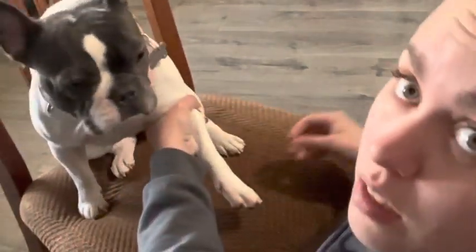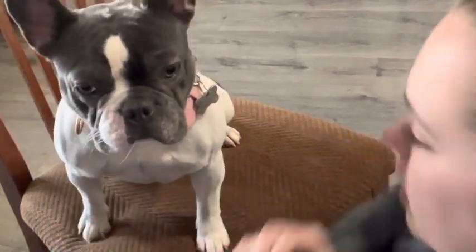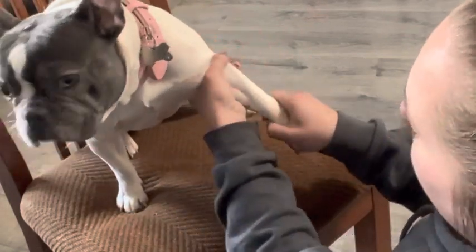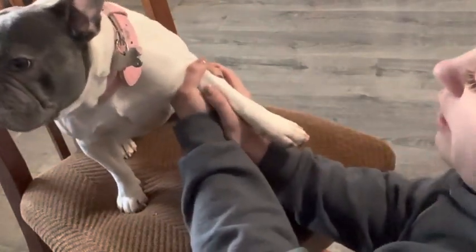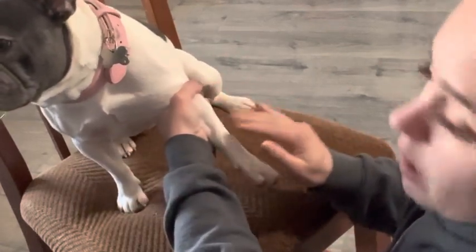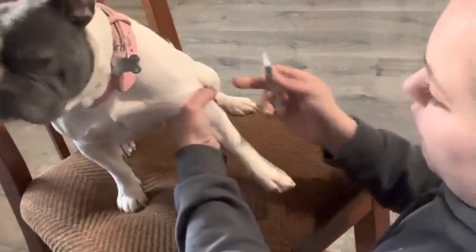I'm just going to let her go for a second while I get this needle ready. So stretch the arm out, grab and twist. If you're doing this alone, it's kind of hard to keep your thumb. A lot of times they put their thumbs right here to stabilize that vein. But when you're doing it by yourself, it's kind of hard — sometimes you have someone else hold that vein for you or hold this part for you.